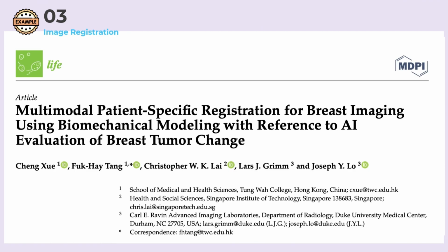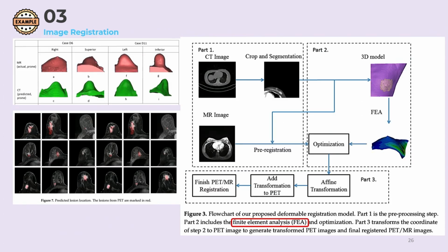For the head and brain, they are rigid, fixed structures, and it's easy. But for the breast, it's a soft lump. It will be challenging, because when we put the patient on the table, whether supine or prone, facing up or facing down, because of gravity the breast tissue will deform, and that makes it challenging when we want to compare images collected from prone or supine positions.